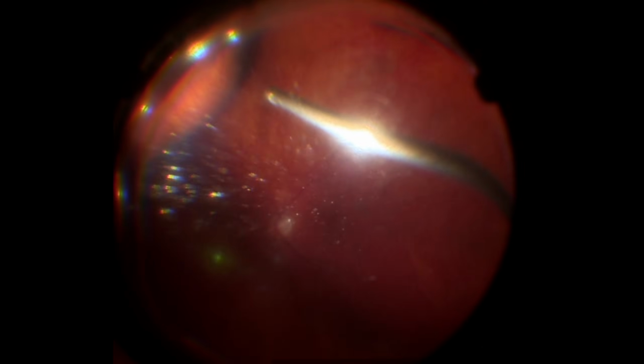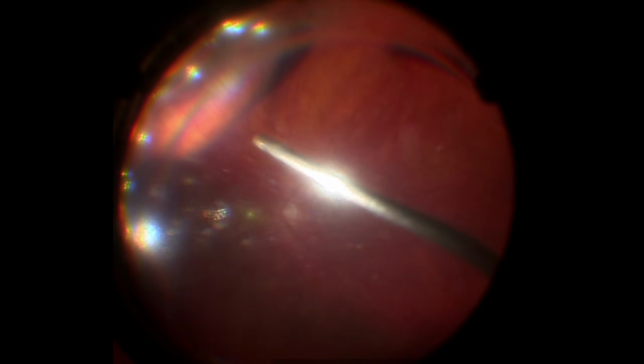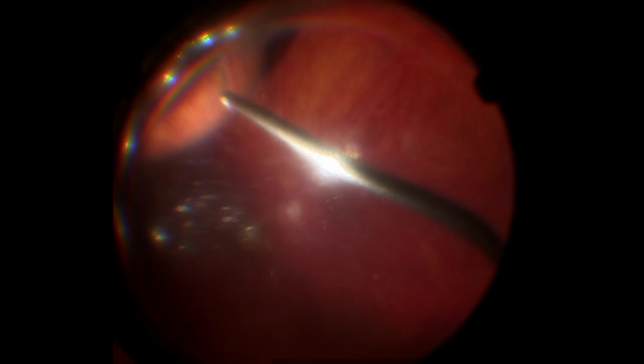I often get asked by viewers what to do when you are dealing with a retinal detachment and can't find a break. There are several approaches and of course they can vary depending on the case. I'll be making a few dedicated videos on this topic because it deserves a proper deep dive. In this particular case, the detachment was localized to the superior temporal quadrant.